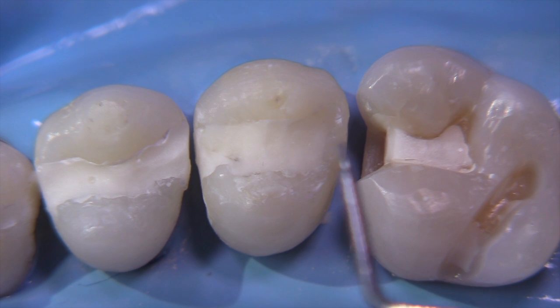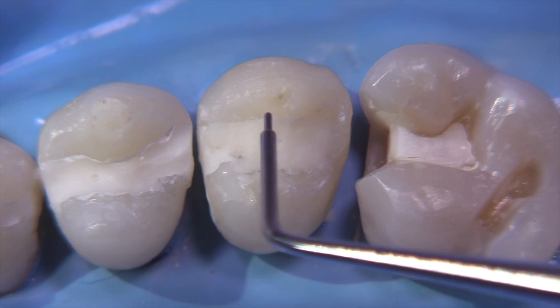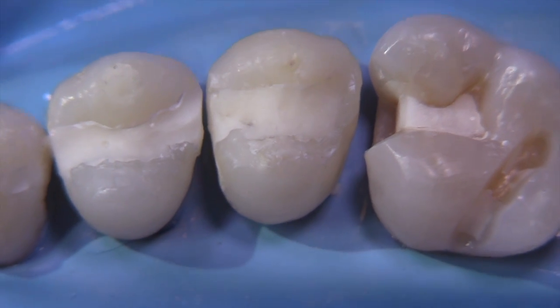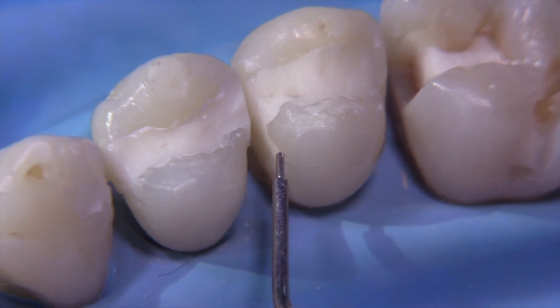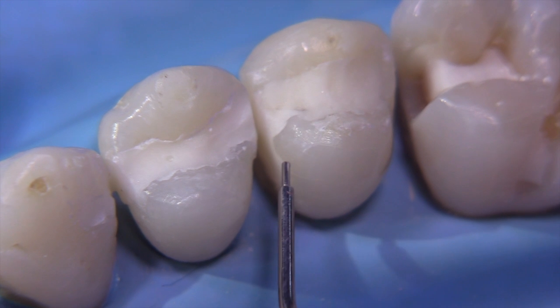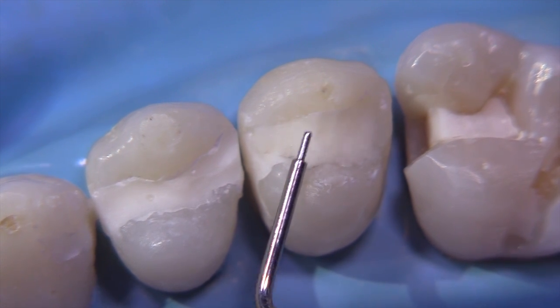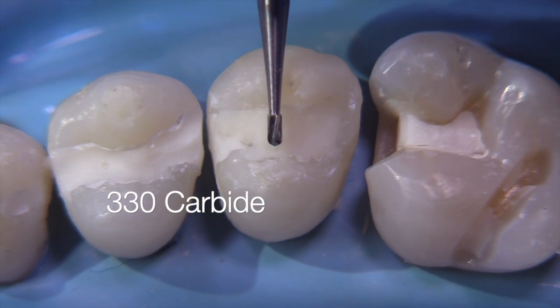So let's get started. Today, we're going to work on tooth number 13, and it's a large MO blockout. It doesn't have much availability for us to make a dovetail because so much tooth structure has been removed in the center area, in the isthmus area. And then on the mesial lingual, a significant portion of the mesial lingual of that lingual cusp is undermined. So our extension is going to have to extend out along this line, which will probably put us in a situation where we have to reduce a cusp.